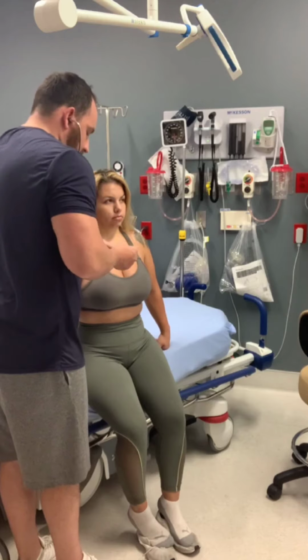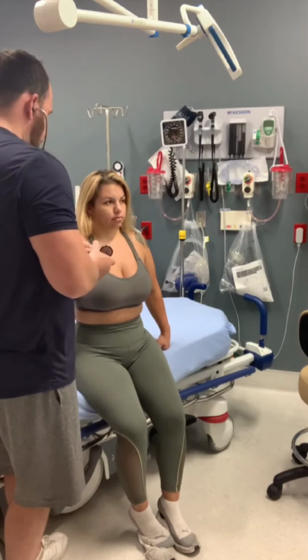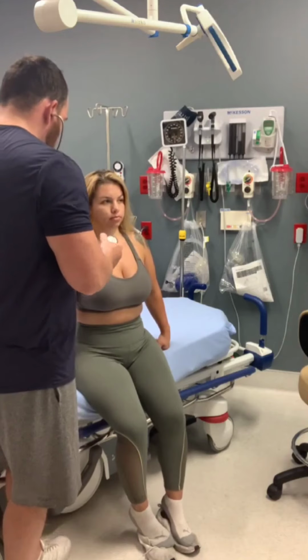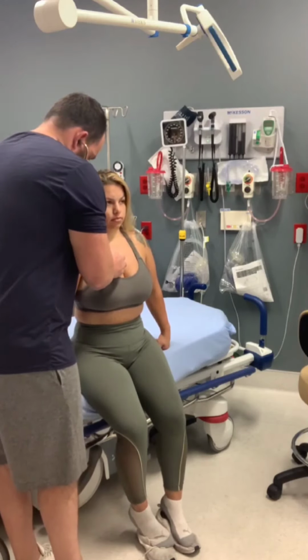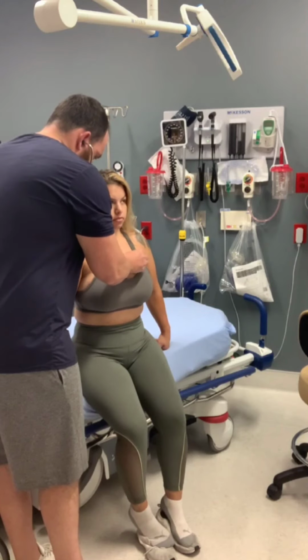All right, now I'm going to switch to the bell. With the diaphragm, we hear the harsher, louder abnormal heart sounds, and with the bell, we hear the softer ones. So that's what I'm listening for here.